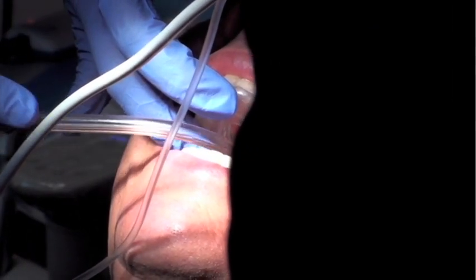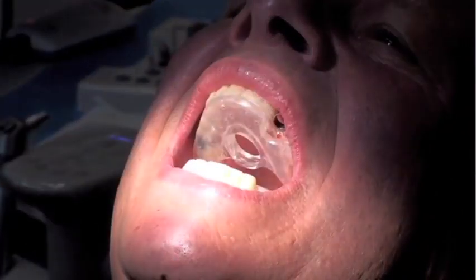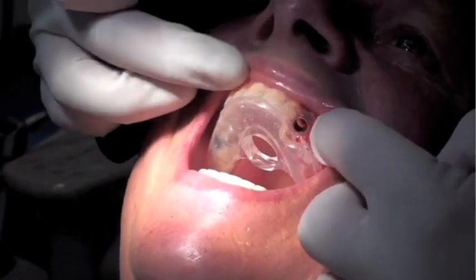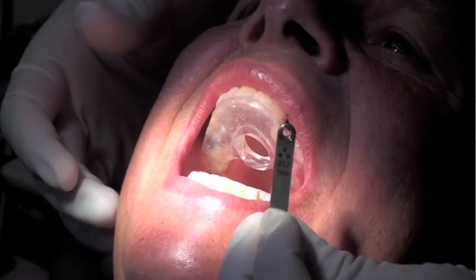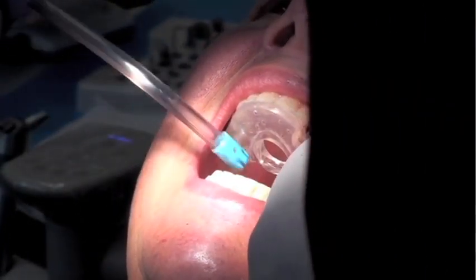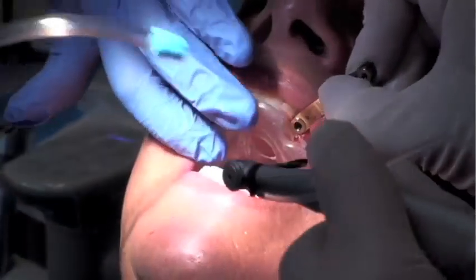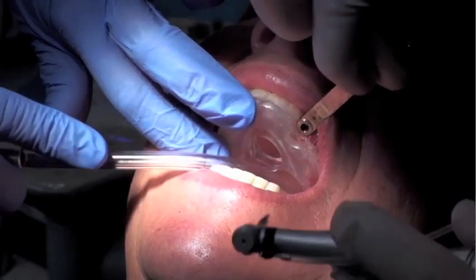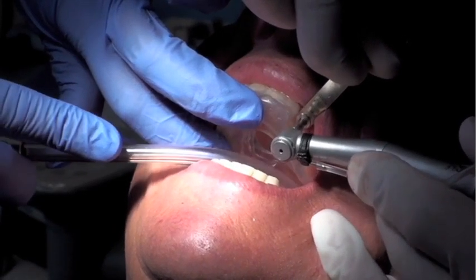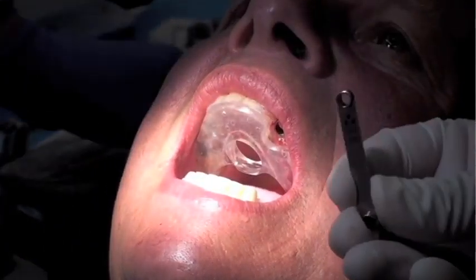This surgery took me a total of 13 minutes, but what I've done with this video clip is abbreviate this version just for time's sake. After the 2.0 twist drill we're going to follow it up with the next surgical key guide — in this case a 3.2 by 1 millimeter key. This allows us to bump up to the next osteotomy yet still be completely guided. If you observe very carefully you can see how accurate this drill is actually being sequenced. There's no wavering and angulation, and the key allows me to go to full depth. There's a stopper that's built into the osteotomy drill. From the 3.2 we go straight to the 4.5 conical.